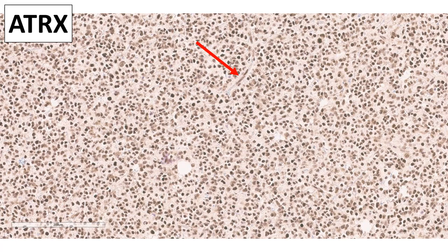It's amazing how in this era of molecular oncologic neuropathology, many of the surgical pathologists do not understand that, and they confuse them, they get them backwards, they use vague language. Ambiguity is never your friend in a surgical pathology report, in a radiology report. Okay, and here's a p53. Absolutely, you can see scattered staining nuclei. Sometimes it's stone cold negative. You can definitely see stained nuclei. I think I call this 5%. That's fine. Only when it gets up to higher percentages is it indicative of a TP53 mutation. But this is very common. This is very good for oligo.